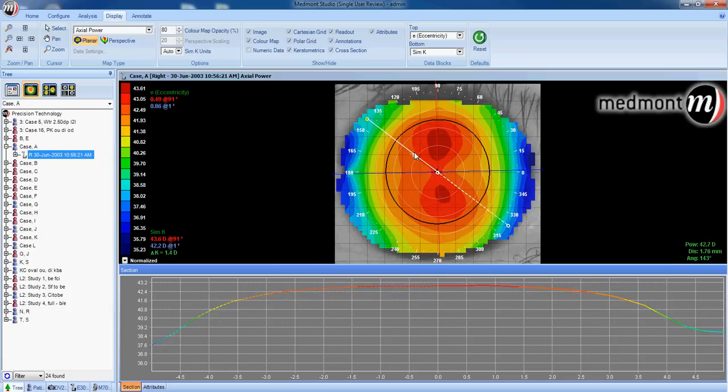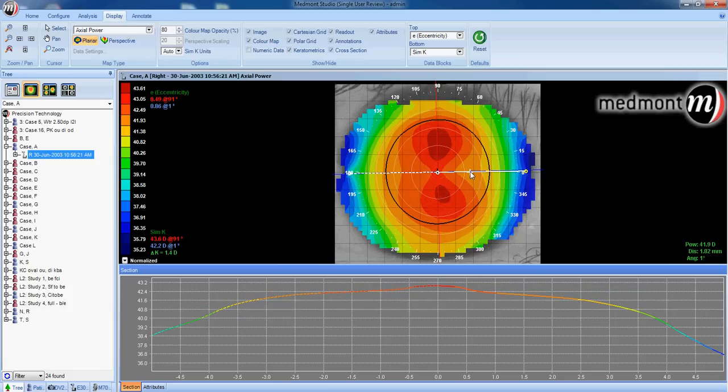observe the graph down below. Along the horizontal meridian, we go from steepest curvature in the center to flattest curvature toward the periphery. 0.86 is the measured eccentricity.